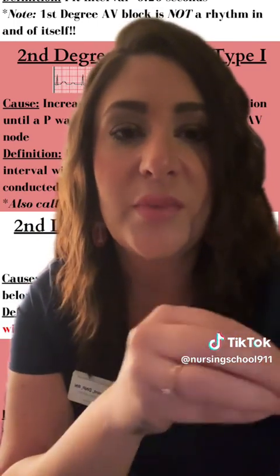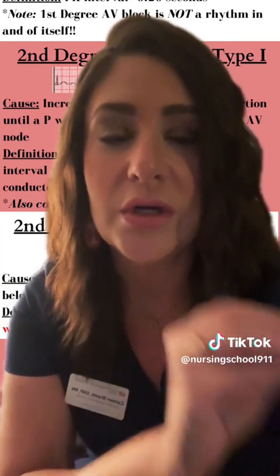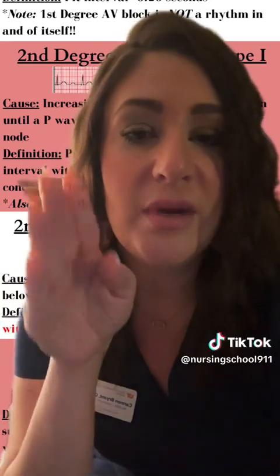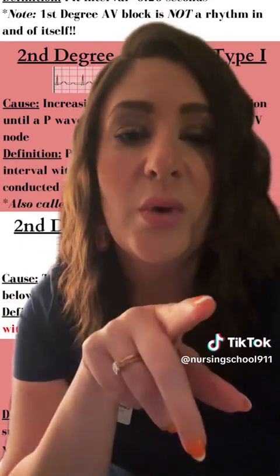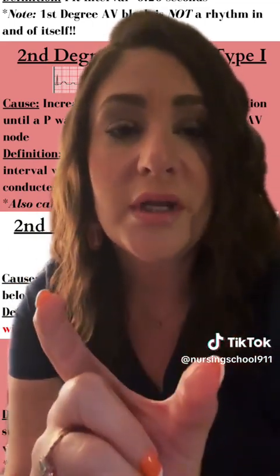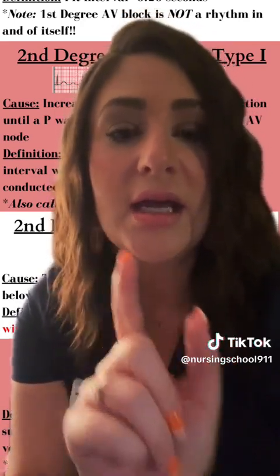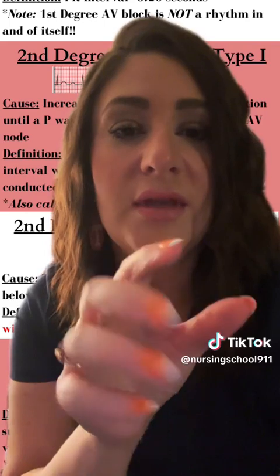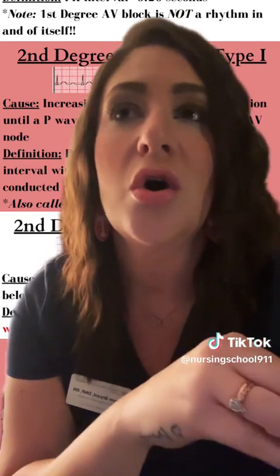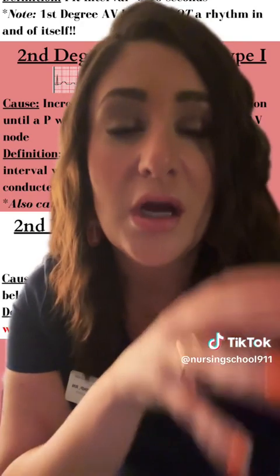It's all about that PR interval, which I think is a misnomer. I think it should be called the PQ interval because it's literally the time measurement from where the P begins to leave the baseline to where the Q begins to leave the baseline. So that's your PR interval. Normally, it is no longer than 0.20 seconds. If it is longer, then this is abnormally slowed electricity. So something is causing conduction to be abnormally slowed through the AV node.